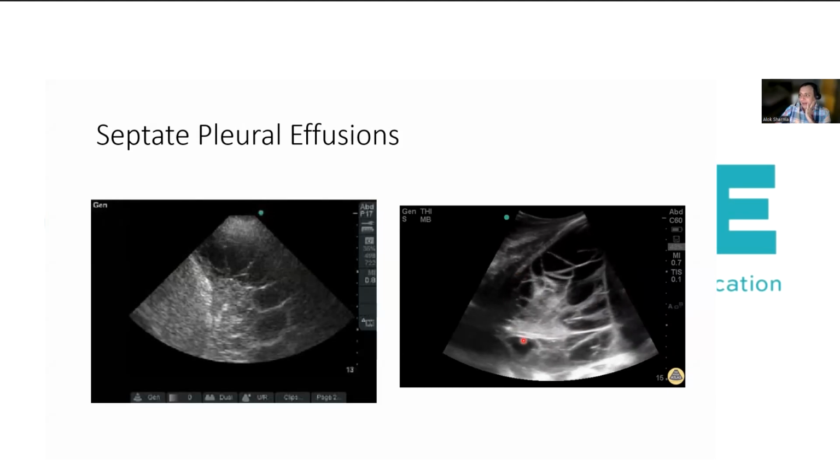Because if you have large areas of pocketed collections which are causing compressive atelectasis and symptoms in neonates, and I've been in that exact situation with a baby in Southampton, where we had evidence of a complete whiteout on one side, but where we placed a drain based on landmark-based guidance in the 6th intercostal space and posterior axillary line, and actually ended up with very little fluid, virtually a dry tap, which was very surprising for us considering we had significant mediastinal shift in a baby where we clinically correlate.